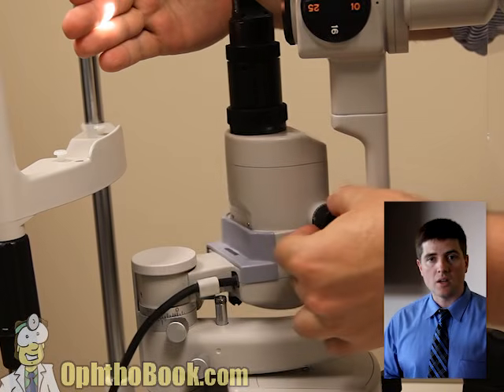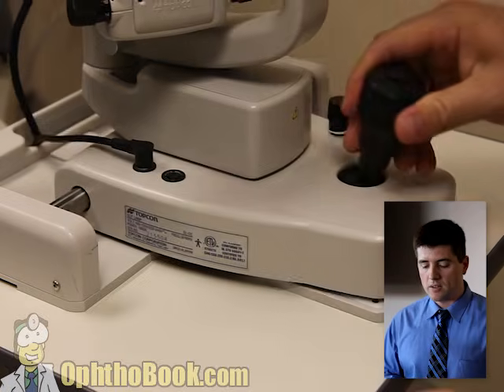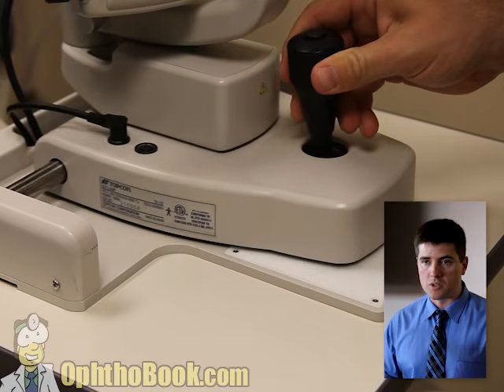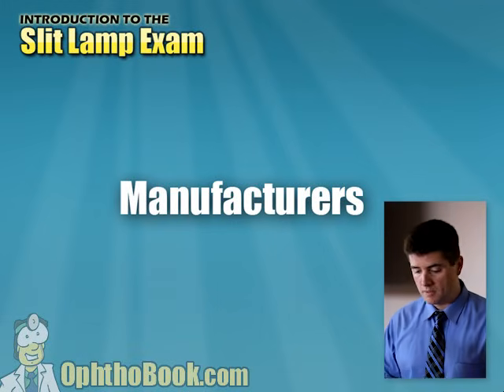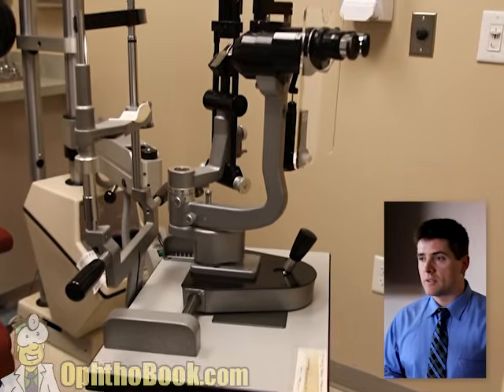There's a light source on some type of swivel device. And finally, there's a tripod, a base that moves as well. This is all very basic for this crowd, but it lays down the basics. Now, different manufacturers make different styles of microscopes.